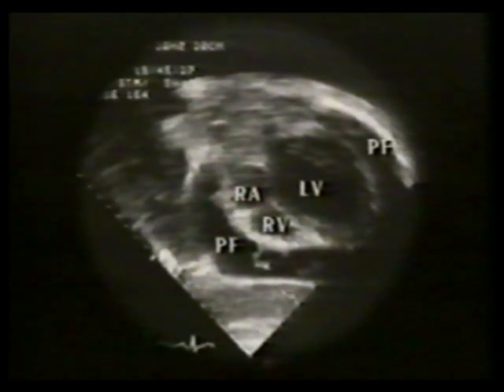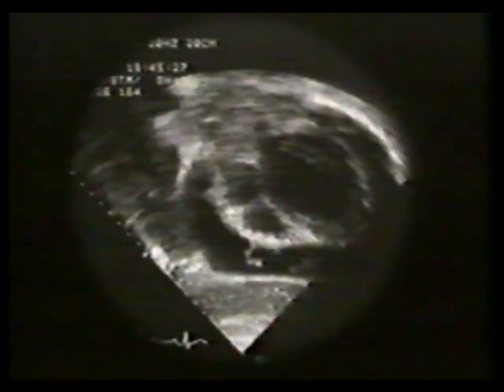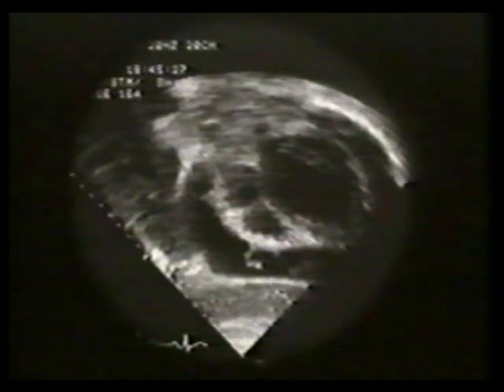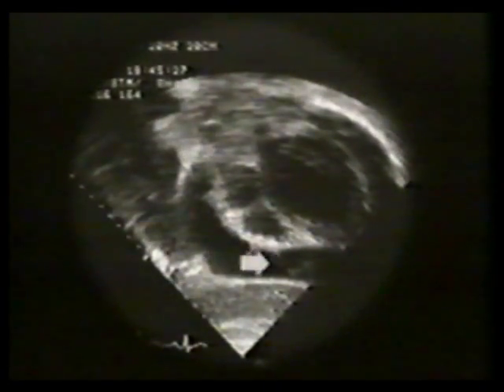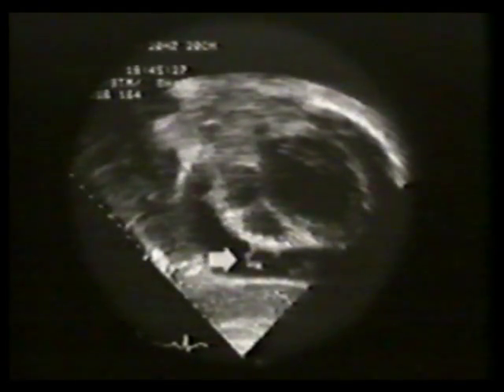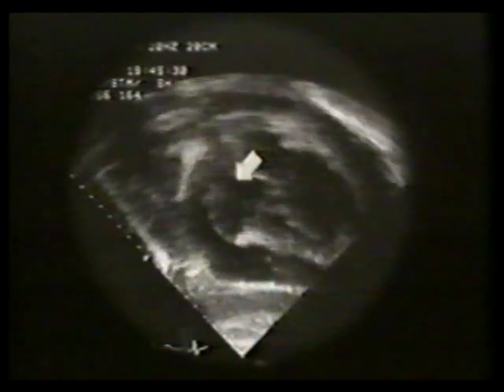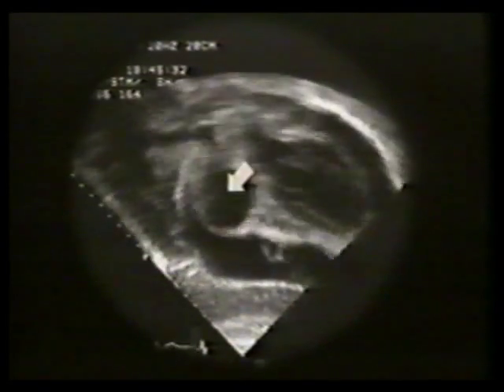This is a subcostal view from the young male with nonspecific pericarditis, whose peristernal and apical images were previously presented. The transducer is angulated to demonstrate a strand of fibrin within this large pericardial fluid collection. These strands are commonly seen with inflammatory and with hemorrhagic effusions. Note also the diastolic right atrial collapse.